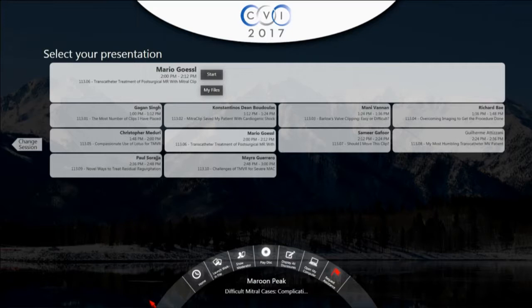It would have to be a flexible ring, right? But I think the Cardioband would get up to the trigones better. If you look at this, it's an incomplete annuloplasty ring. It looks like it did not go all the way up to the trigones, which is, I think, why she developed more MR. In addition to that posterior leaflet, probably scarring down after it was resected. I mean, that's my interpretation. I think even if it wasn't a very flexible band, if you went all the way up to the trigone and pulled it up, I think you'd fix it. I mean, the ring was improperly put in. But you make a good point. We haven't done a lot of these in pigs and animals to see, with rings in them, to see what's going to happen.